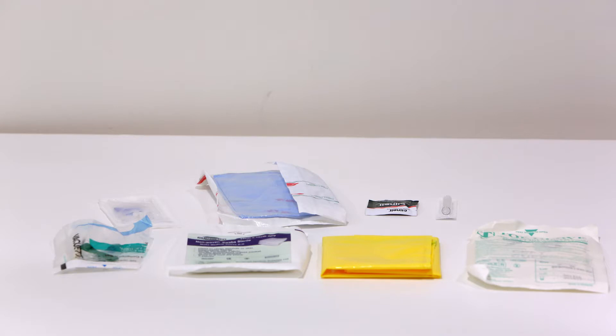The contents of the adult blood culture pack include a pair of sterile gloves size 7.5. If you use gloves of a different size you will need to obtain the right sized glove for you from the ward.